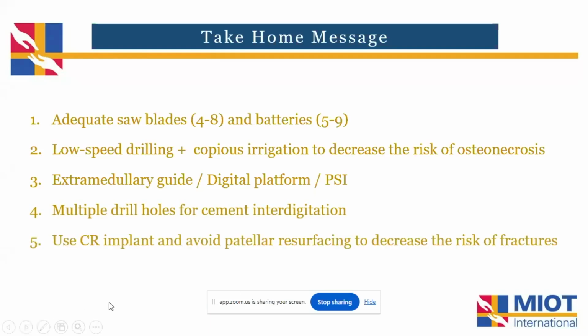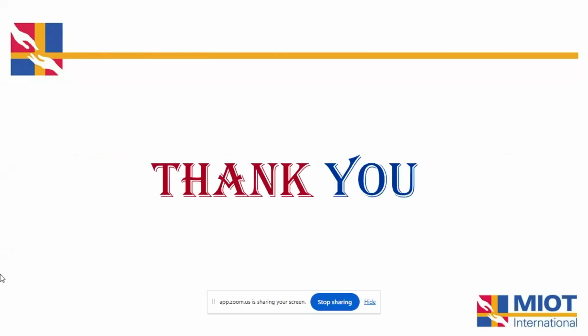And when you choose the implant, you choose it wisely. As much as possible, try to avoid a PS implant, and if possible try to avoid patellar resurfacing because of the brittleness of the bone. Thank you.